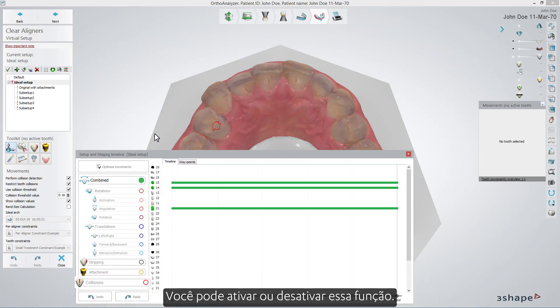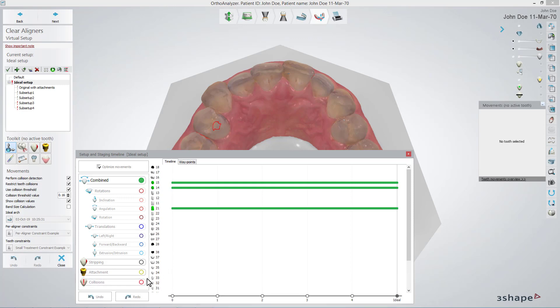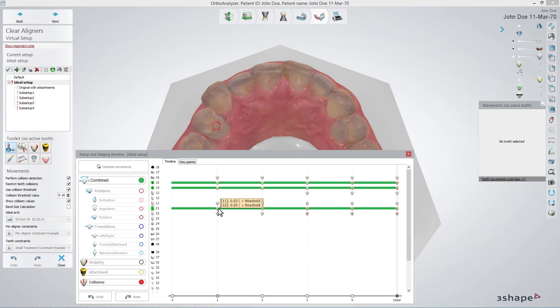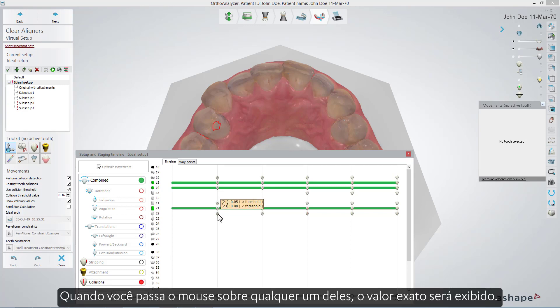You can switch that function on or off. Again, the red and grey exclamation marks indicate the severity of intersections. When you hover your mouse over any of them, the exact value will show up.